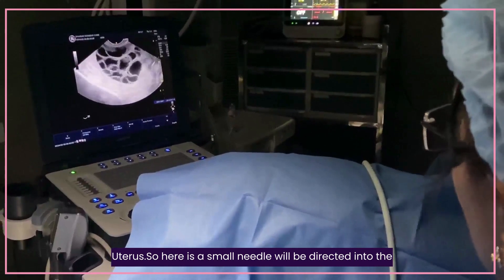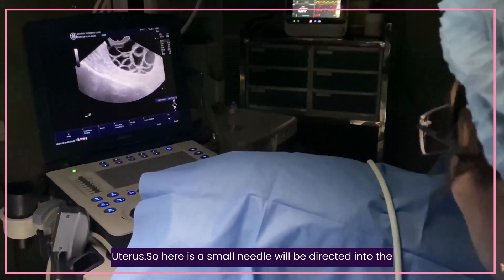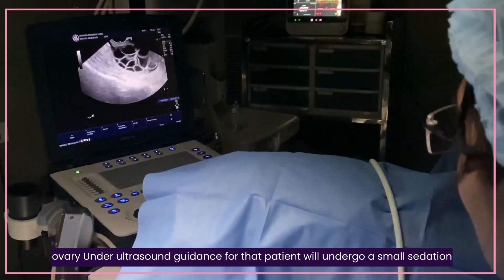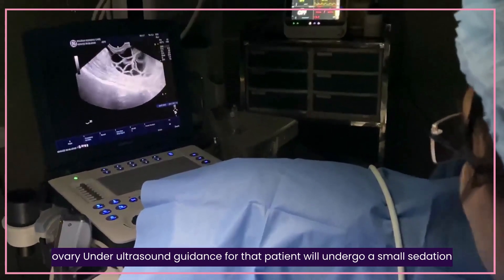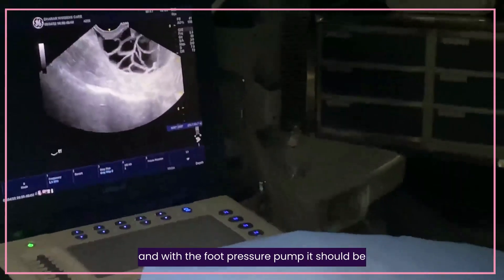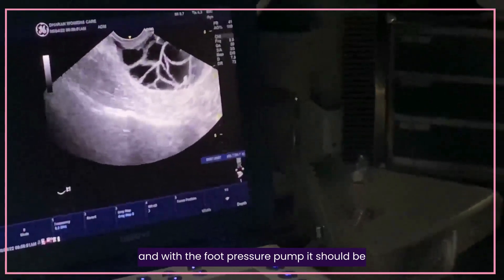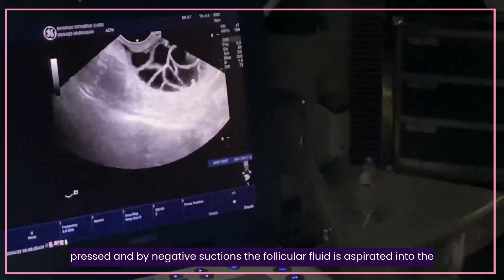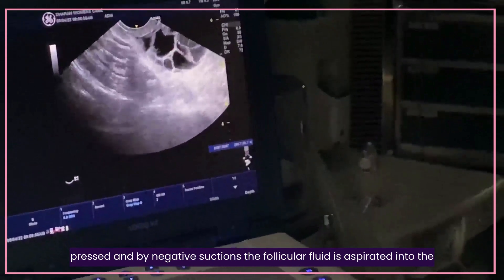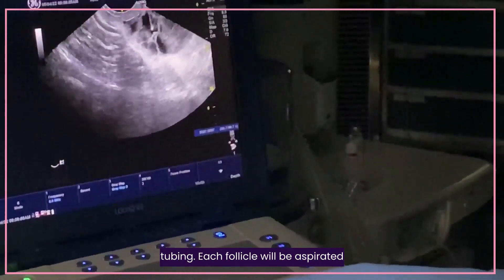A small needle will be directed into the ovary under ultrasound guidance. For this, the patient will undergo a small sedation, and with a foot pressure pump pressed by negative suction, the follicular fluid is aspirated into the tubings.